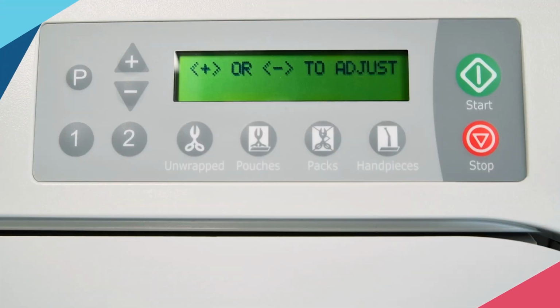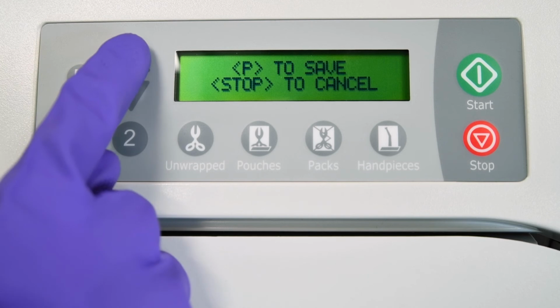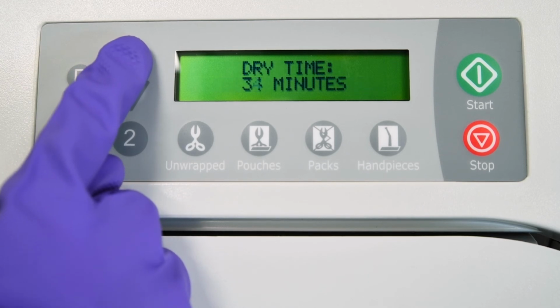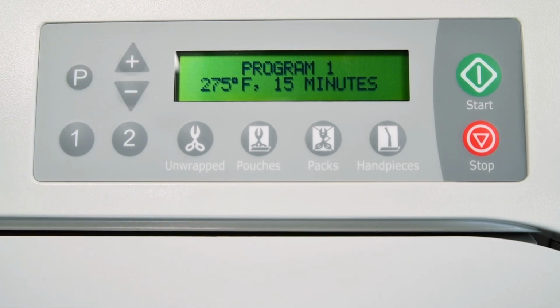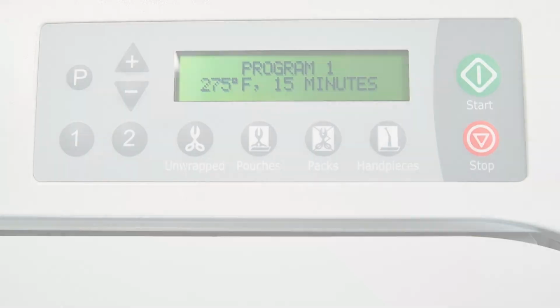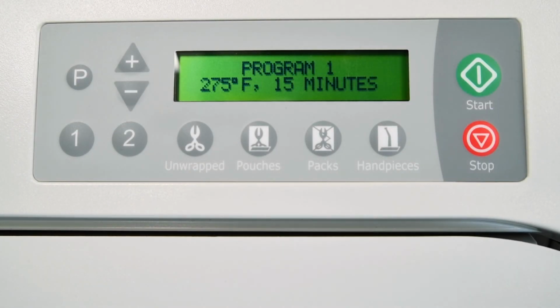The display will now show drying time and the current number of minutes. By pressing the plus or minus button, the drying time can be changed in 1-minute increments. Drying time can be set from 0 to 60 minutes. When the desired drying time appears on the display, press P to store the program and complete the custom cycle programming process, or press stop to abort changes and revert to the original settings.